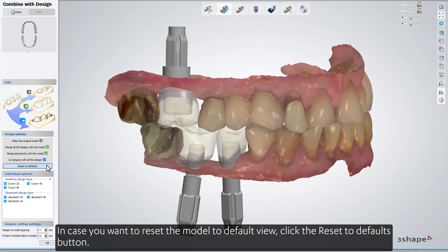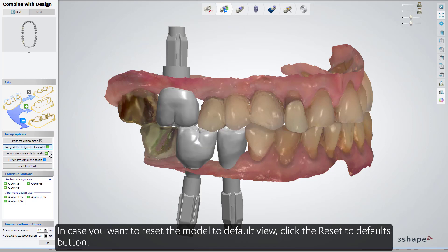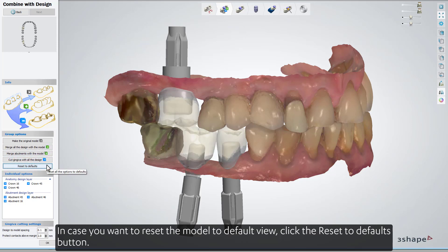In case you want to reset the model to the default view, click the 'Reset to Defaults' button.